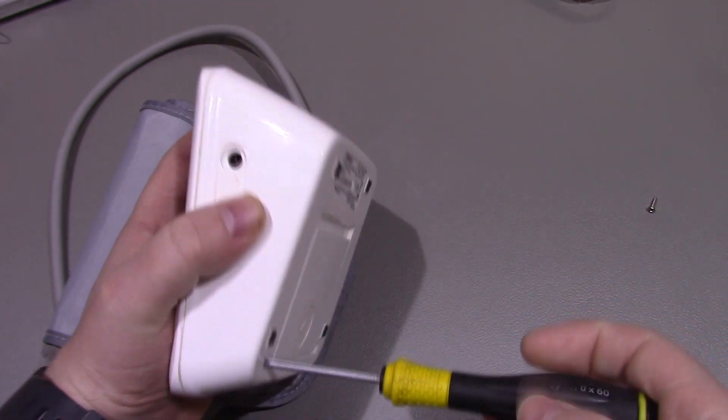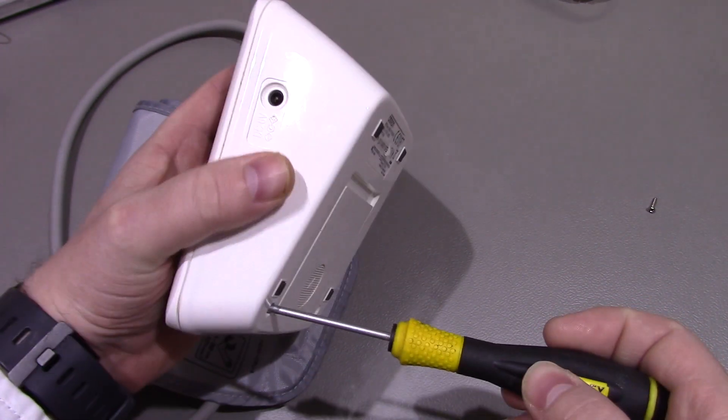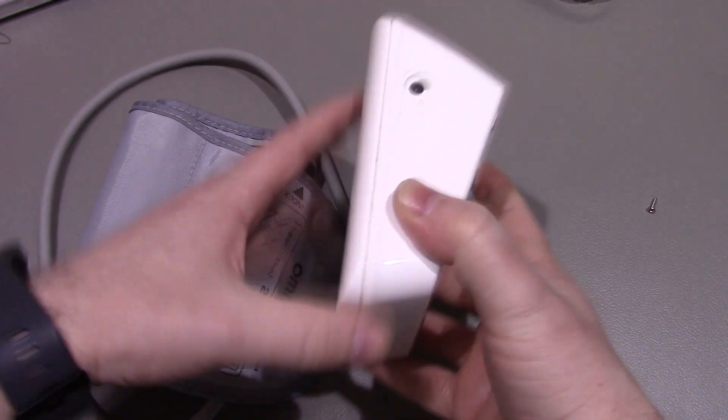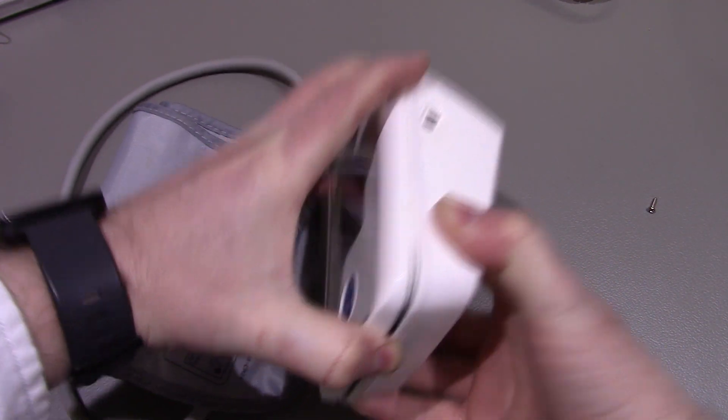It has got a DC barrel jack on the side there, which is a 6V input. It doesn't come with an adapter - I think you have to actually get those separately.